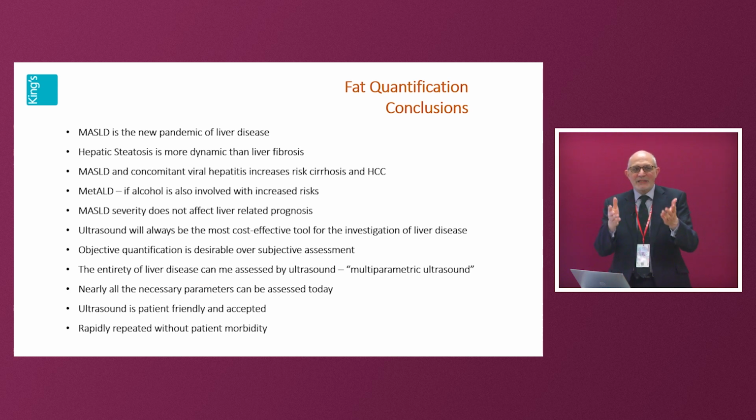Compare that with the patient going to CT or MR. The technician puts them in a gown, puts a line in, puts them in the room. It's all cold and quiet, then bang, and the noise starts, and then they inject contrast in CT. It's hot everywhere. They see everyone watching, and you lying there. And then the door opens, and someone comes in, takes the cannula out, presses on that. Bye. Someone will be in touch in two weeks with the report. The difference for the patient is phenomenal.